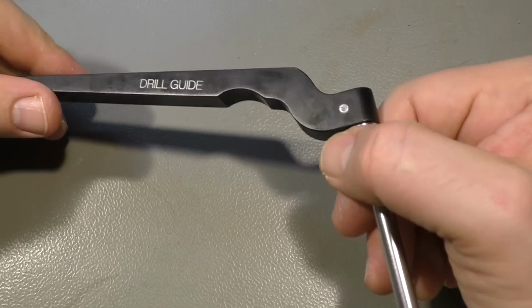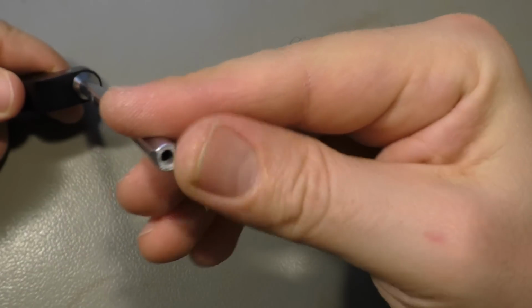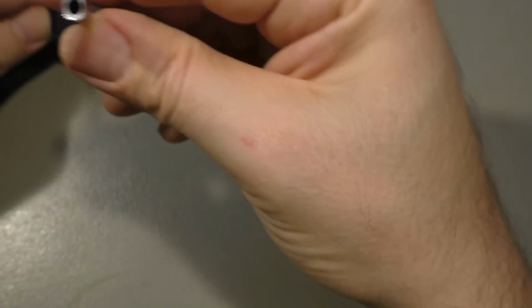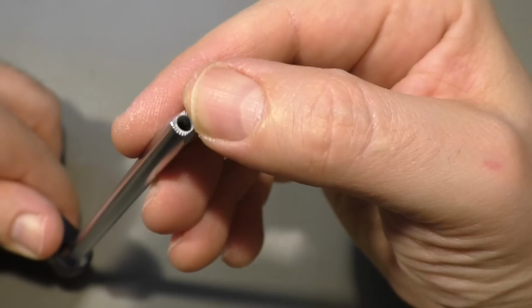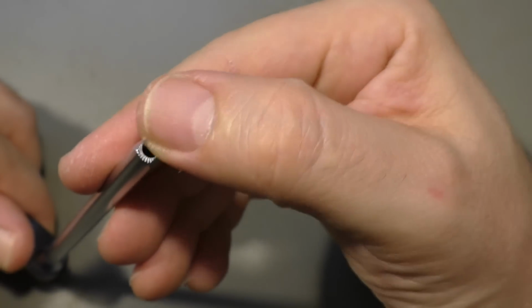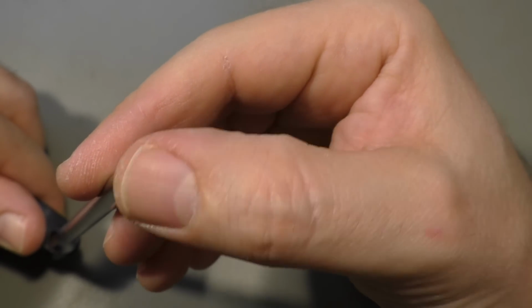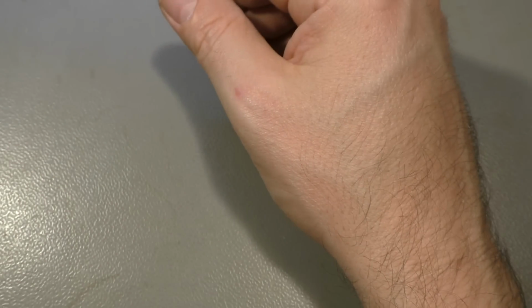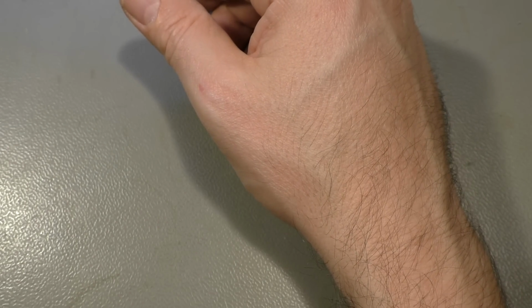And of course that drill guide we have seen in action. It can be pushed against the bone so it won't slip around, because it has some teeth that grip very well. Well, I think that's what's in the first drawer.